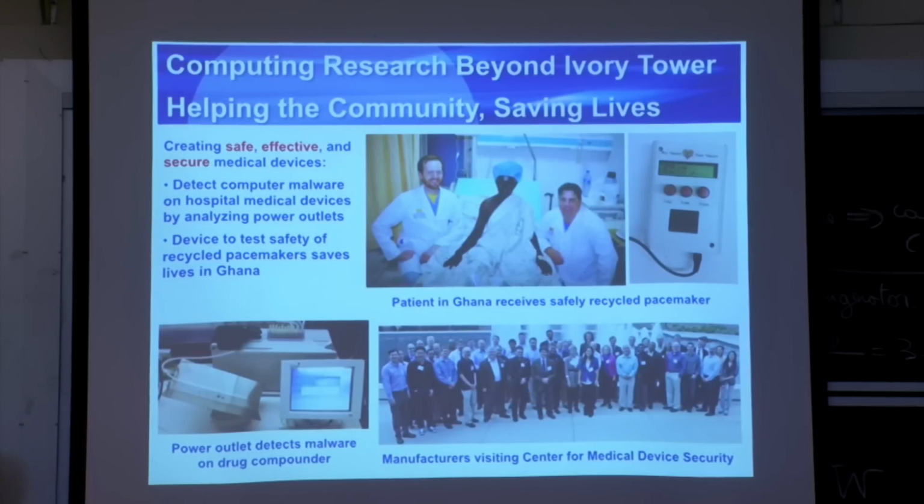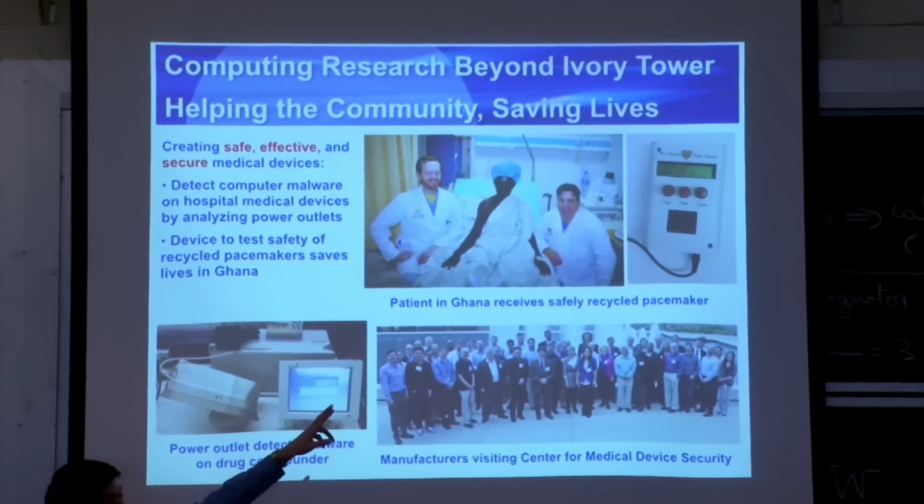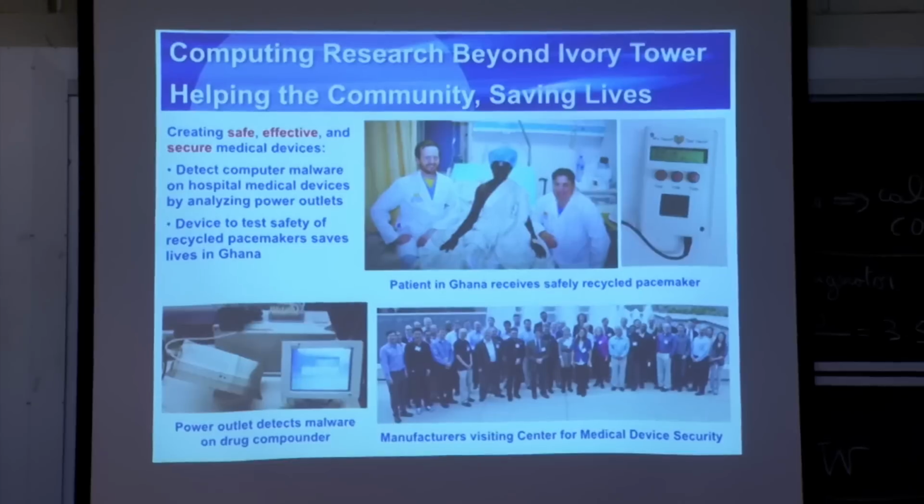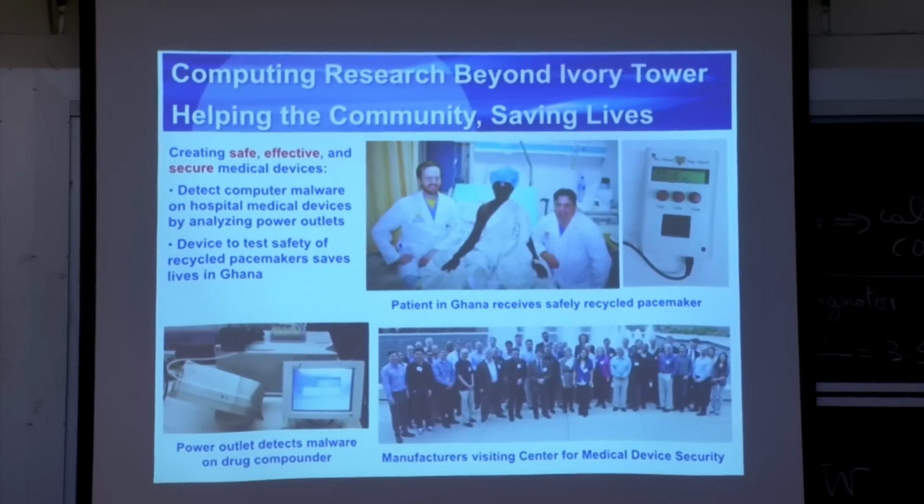But then what about some of the other things? Has some of the metal corroded? How do we do an end-to-end check to see if it can still detect arrhythmias properly? So the students in my lab created a special tester that sends out what you would see from the electrical components of cardiac arrhythmias, that is things other than sinus rhythm, cardiac rhythms that you wouldn't want to have, right? So anomalies.